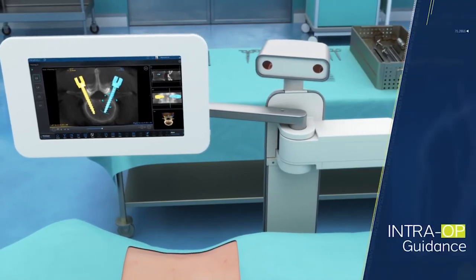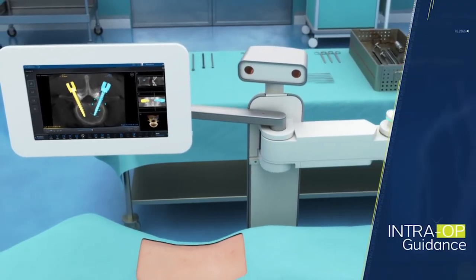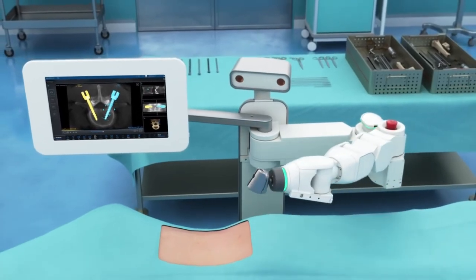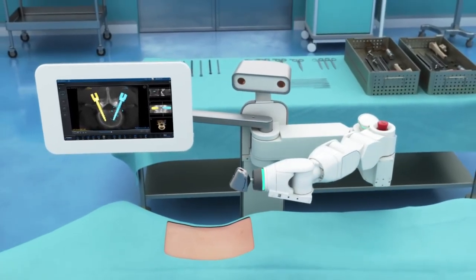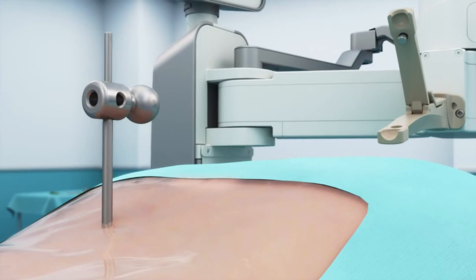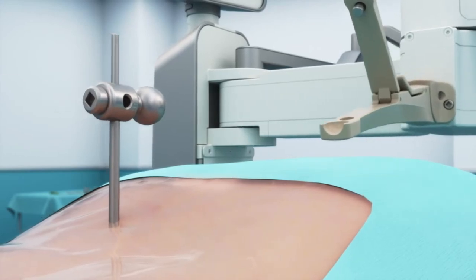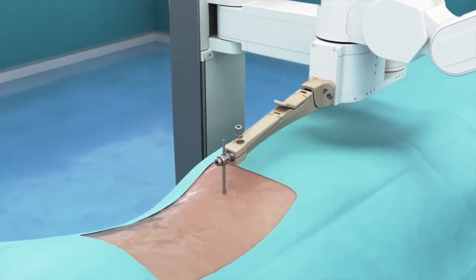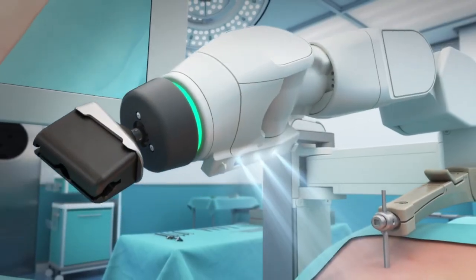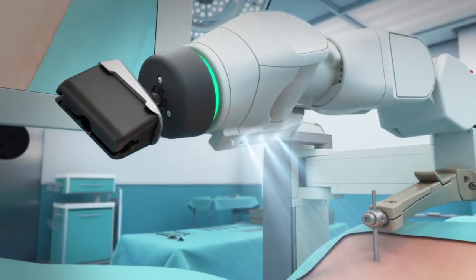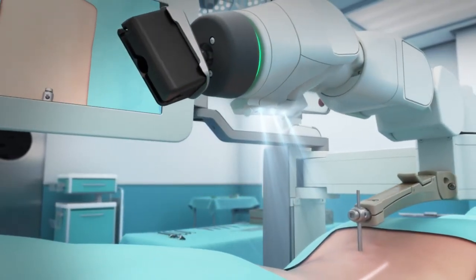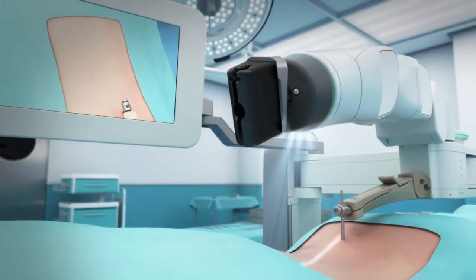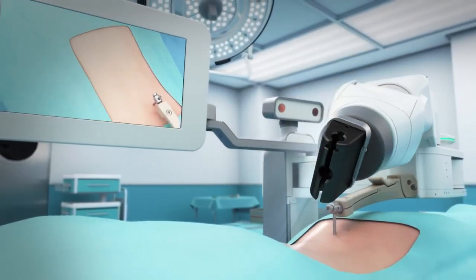Intra-op guidance utilizes precision mechanics and the surgical arm to guide tools according to the surgical plan. This portion of the procedure begins by rigidly attaching a mount to the patient's spine. Once the platform is mounted, the 3D camera maps the surface of the patient and the surrounding area to produce a 3D image of the entire surgical field.